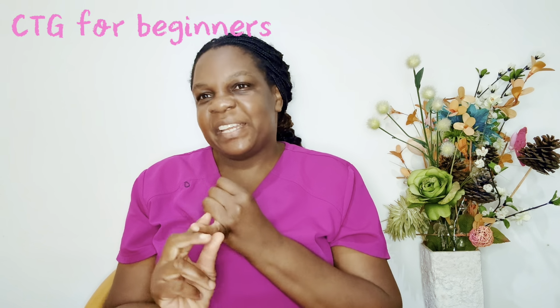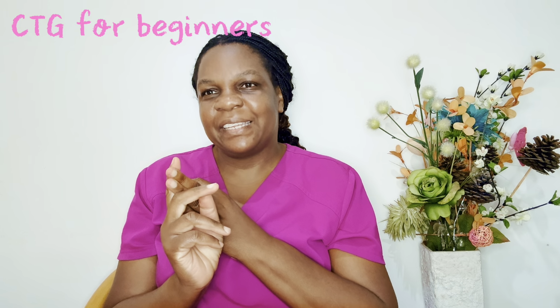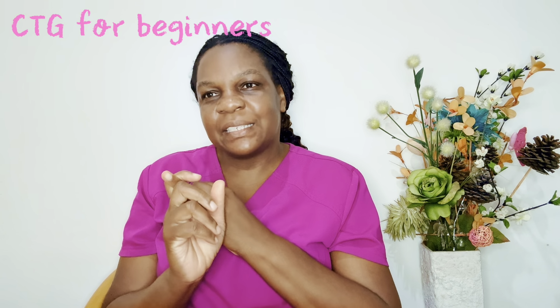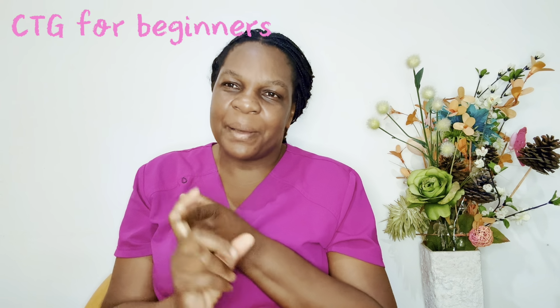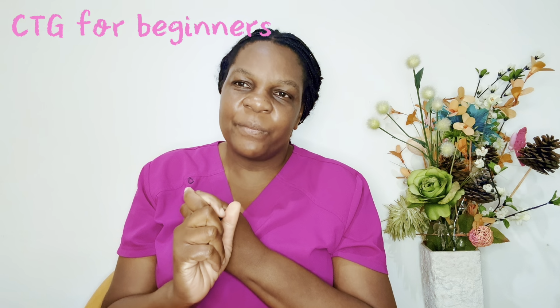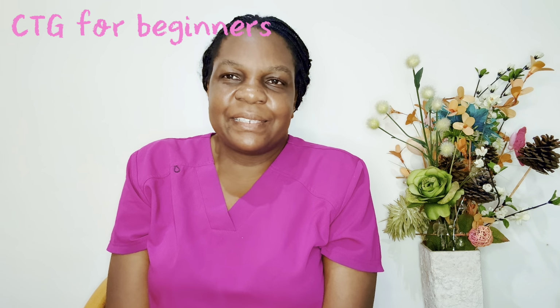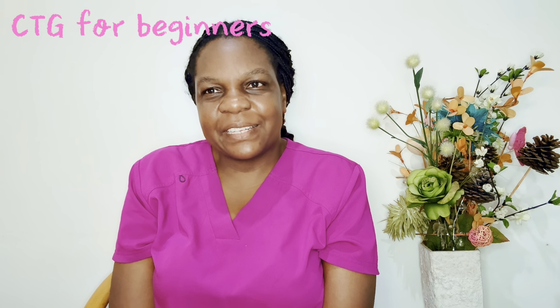Baroreceptors: pressure, fast and shallow decelerations, quick recovery. Chemoreceptors: oxygen lack, slower, deeper decelerations, slower recovery. In baro, it means too much pressure. Chemo, I need more oxygen. Right, now let's move on to contractions and their effects.